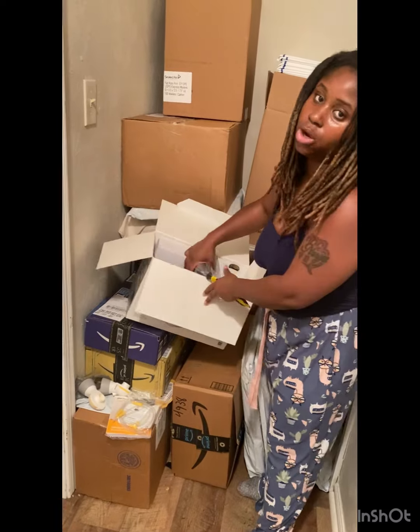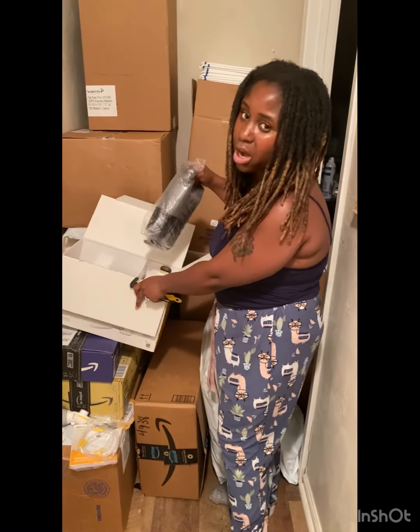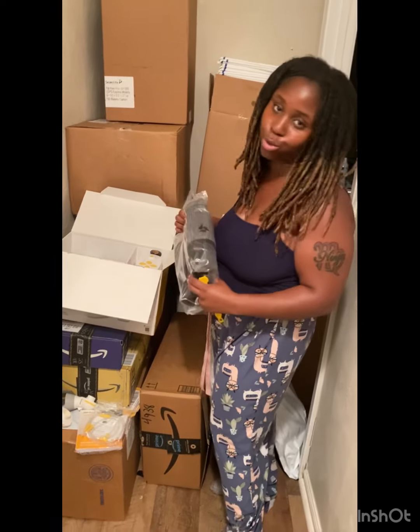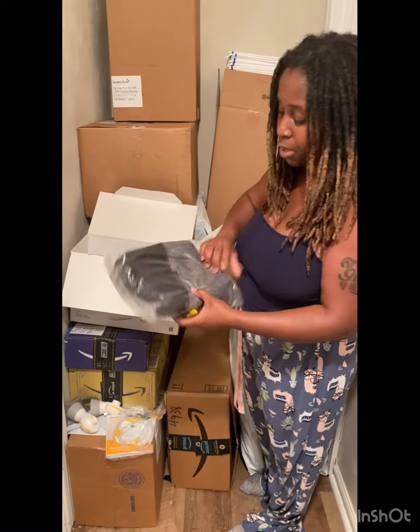Y'all, I'm not really familiar with Medela because I usually get like Spectra and all that. So I have Spectra pumps and I also have Medela pumps, but I don't have this one. So I'm not really that familiar with it. I do have a few Medela pumps, but I don't use them. I got like five pumps, but I just use the Spectra and I barely even use that one. So this is something new for me, you guys.